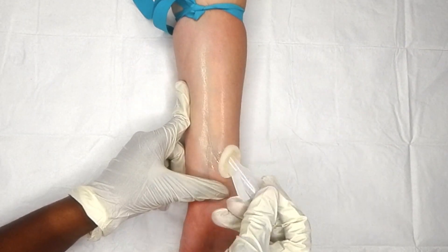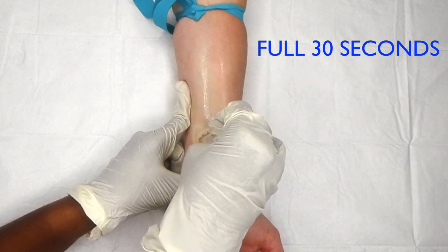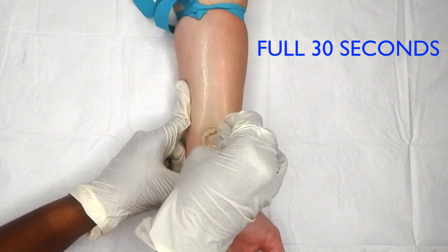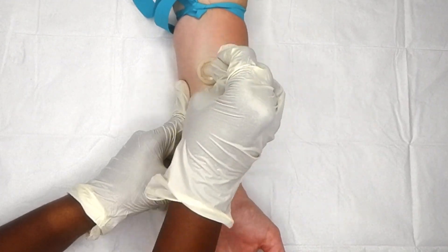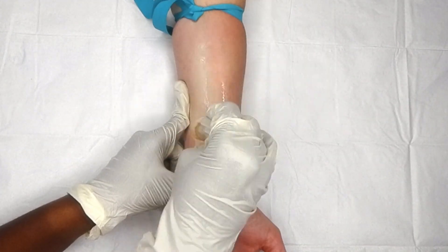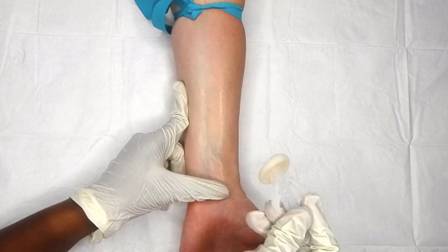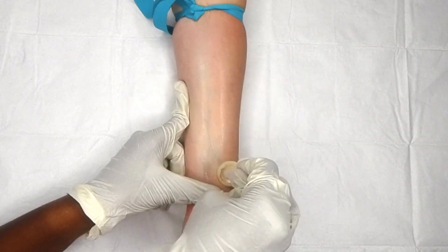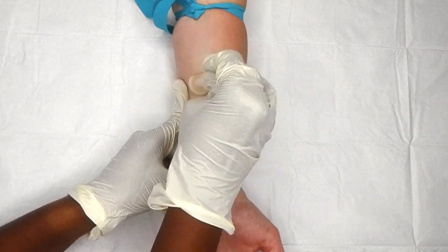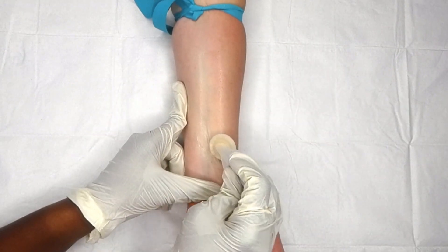First, I locate the spot by sight and palpation, and then I move to properly prep the skin. The standard of practice is to wipe the site for a full 30 seconds. A three-move swipe is not enough to properly clean the skin. If you want this IV to last, wipe it for the full 30 seconds.